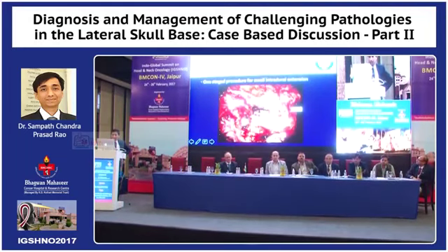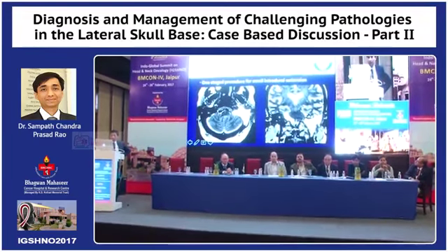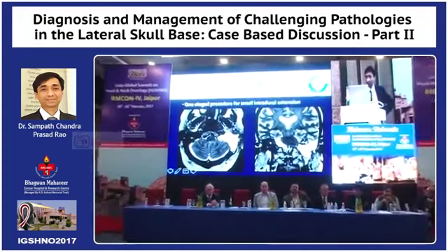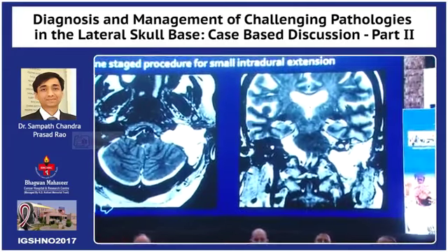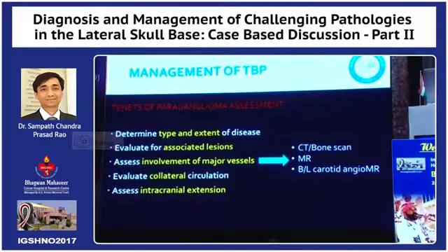See, the labels are self-explanatory, so we found this small piece going inside here. I'm sorry that the label is covering it. And then we went ahead with the surgery, and then we had this defect, which is not so big. It looks big because it's under the microscope. And then we went ahead and plugged fat, put fibrin glue, exactly what the panelist told me. And in this case, we didn't apply the concept which we preach, which is to do a second stage surgery because it was a small defect. So far so good. So all of us are in concurrence.